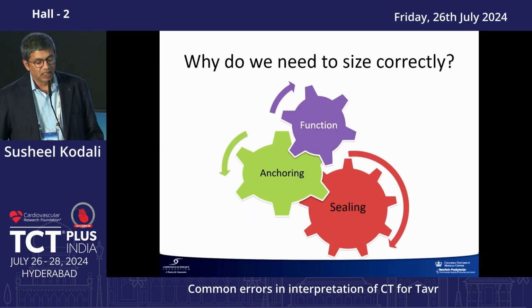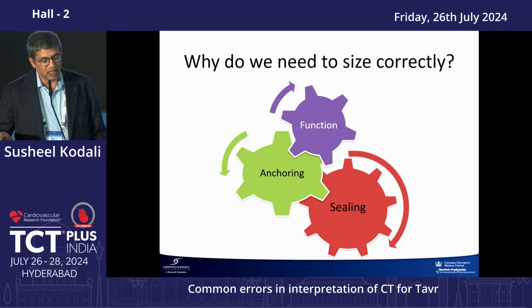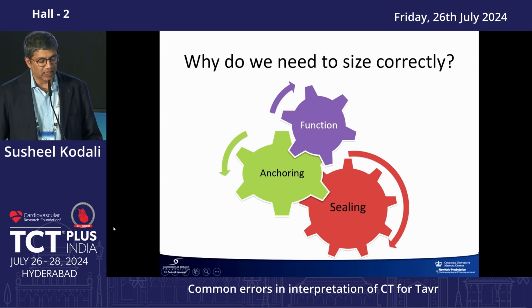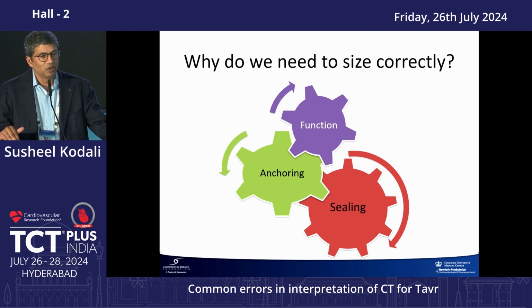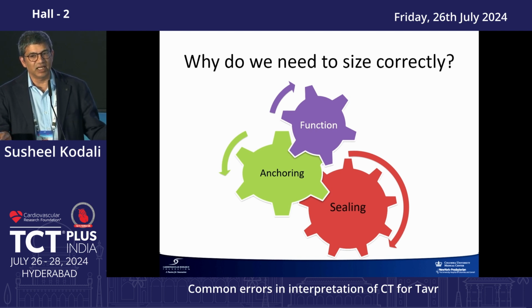If I rehash, looking at CTs and why we need to size correctly. Fundamentally, unlike surgery where you're removing the valve and sewing it in and creating a seal, we have to do that in the native anatomy. And we have to do that with the TAVI in a native anatomy that is really variable. So the valve has to anchor, it has to seal, and it has to open appropriately.